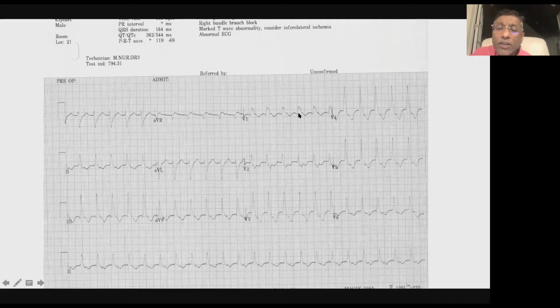Now, how do I know that that's a Q wave? This is a very helpful tracing for me to see that. When you look at the onset of the QRS in V2, do you see this heavy line here? Can you see that the QRS starts to the left of that line? Yes, sir. Okay. Can you picture in your mind that the QRS is actually starting there and not on the line itself?